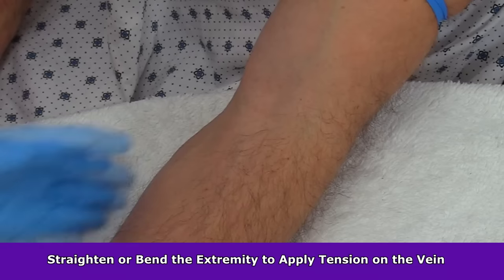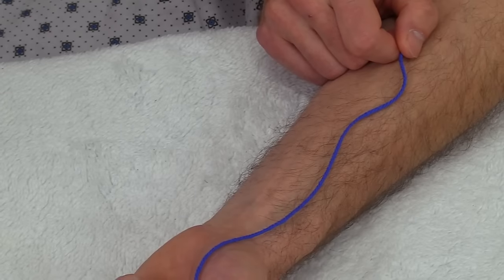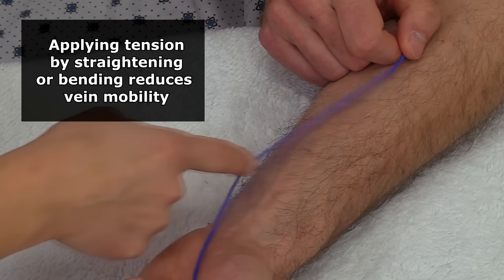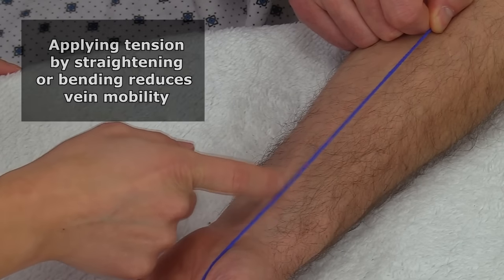There are two important steps to follow when anchoring any vein. The first step is to create some tension on that vein. You do this by having the patient either straighten or bend the extremity to naturally stretch the vein out. To illustrate this, picture a piece of string — when it's just sitting there it can move in almost any direction, but when you apply tension to the string, it loses much of its mobility.